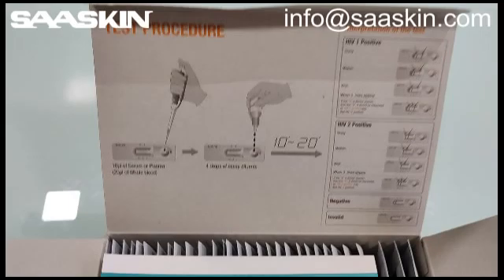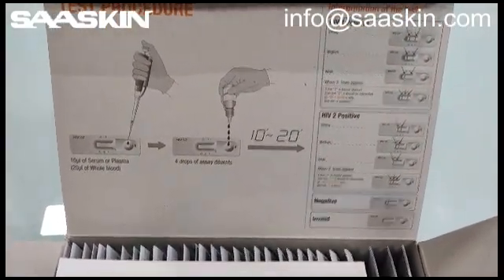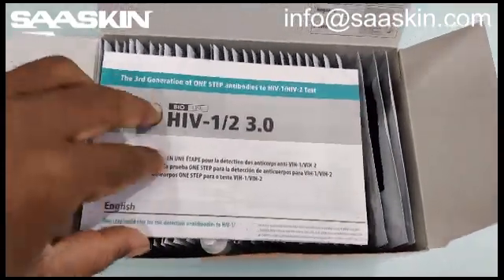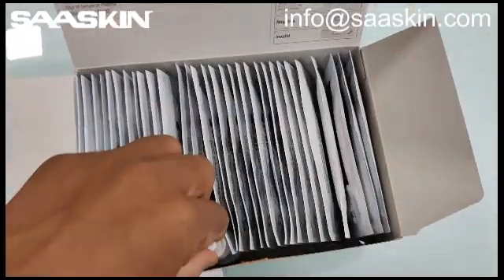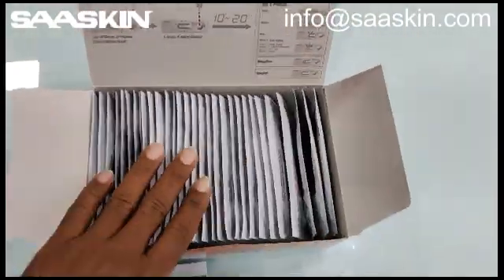In the inside of the box you can see the test procedure is already shown here — you can take a look at that. Let me show you the contents inside. Here is one instruction manual. It contains one instruction manual and one buffer solution bottle that is to be used for all 30 test cassettes. And you have 30 test cassettes here.